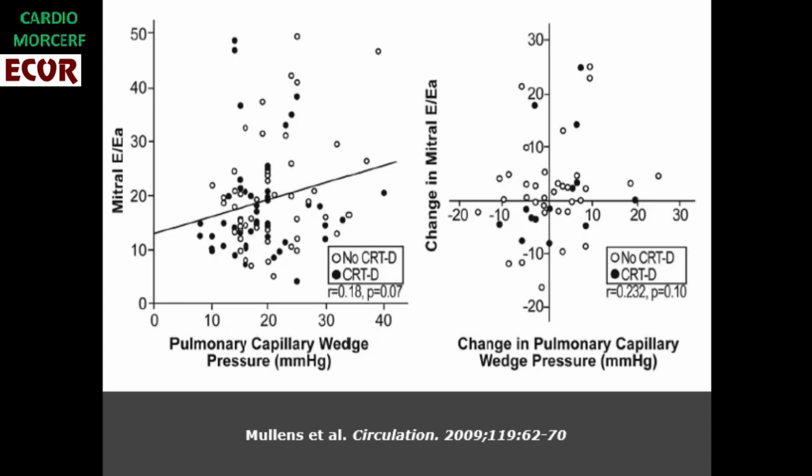Studies from the Cleveland Clinic showed almost no correlation in ICU patients, and when the pulmonary capillary wedge pressure was altered medically, the change in E/E' did not correlate with the direction of change. In my opinion, we cannot trust the accuracy of this spectral tissue Doppler to analyze the pulmonary capillary wedge pressure.